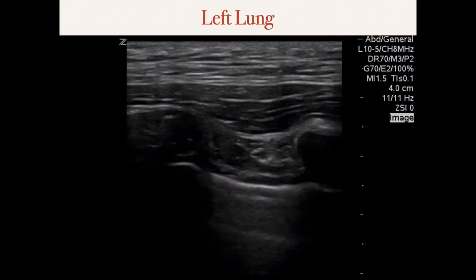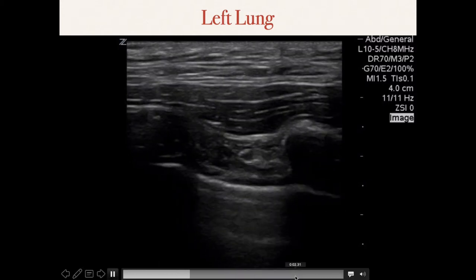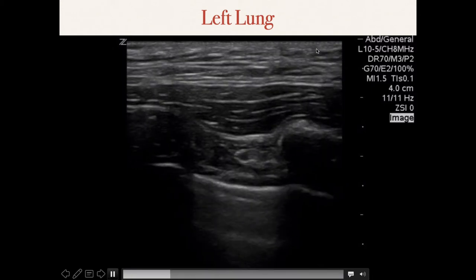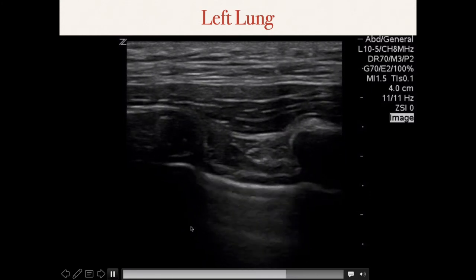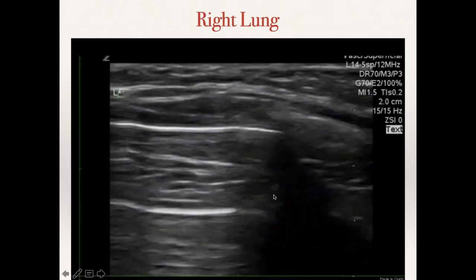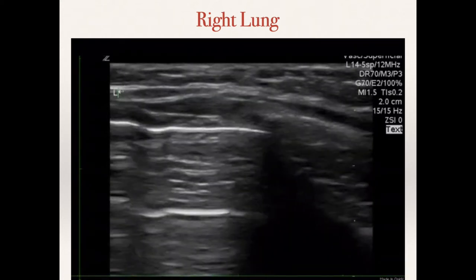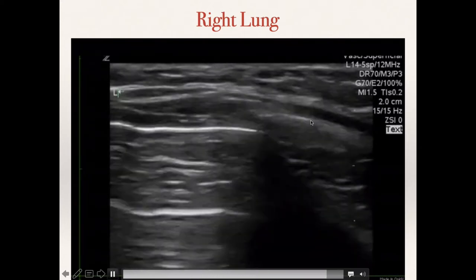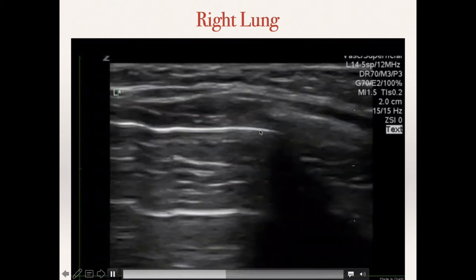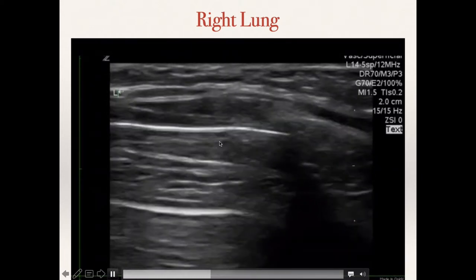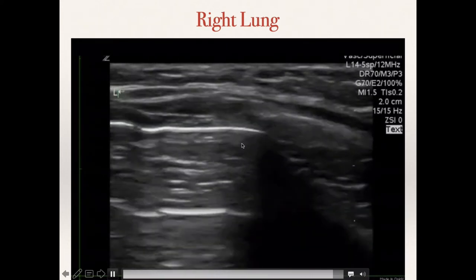Here is the left lung. We're using a linear array for really nice definition. You can see the rib shadow, intercostal muscle, the pleural line, an A-line below, and nice sliding. On the right lung, there is a rib and shadow, and it almost looks like there is pleural movement here. But if you really focus on the pleura, there is no sliding, no comet tail artifacts - just an A-line. So different than the other side.